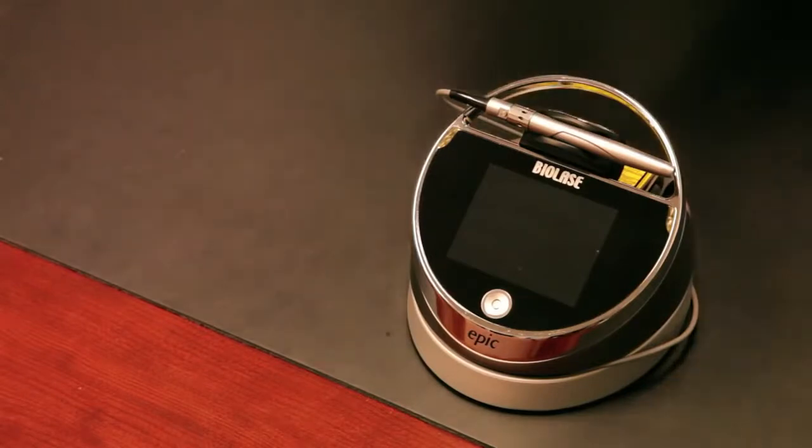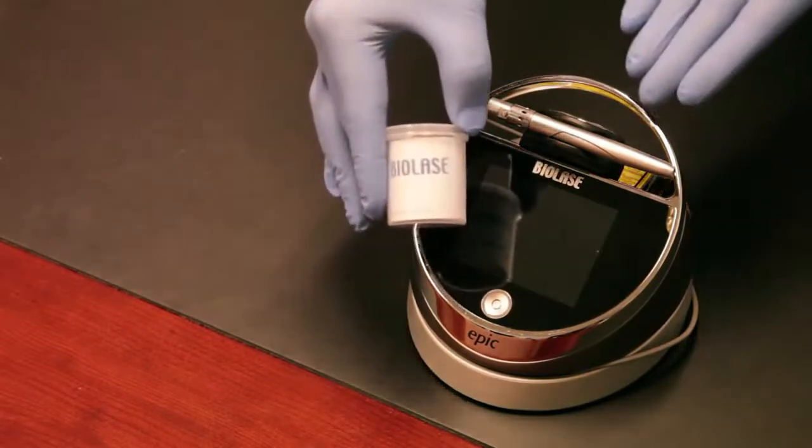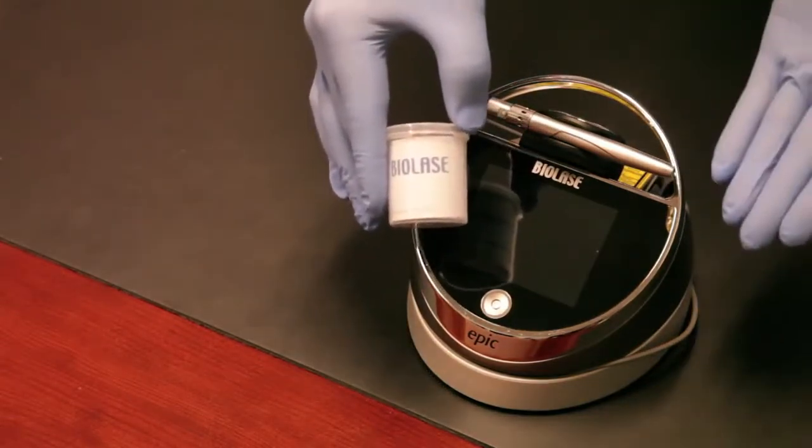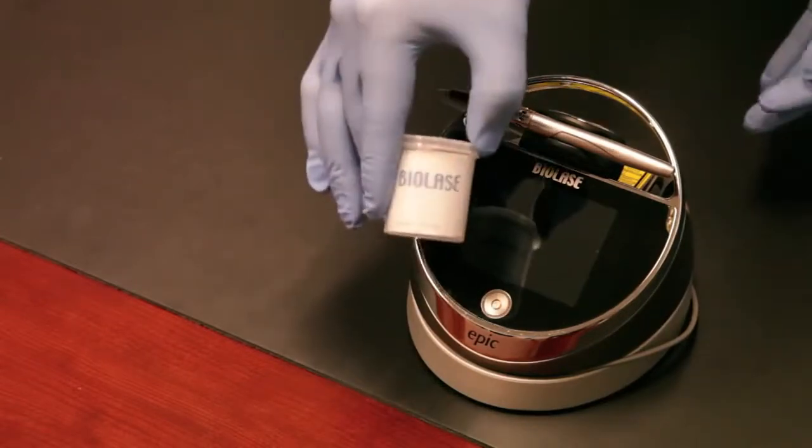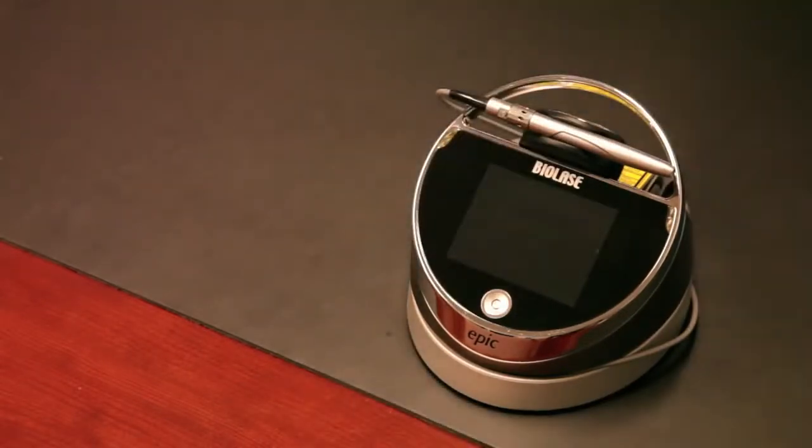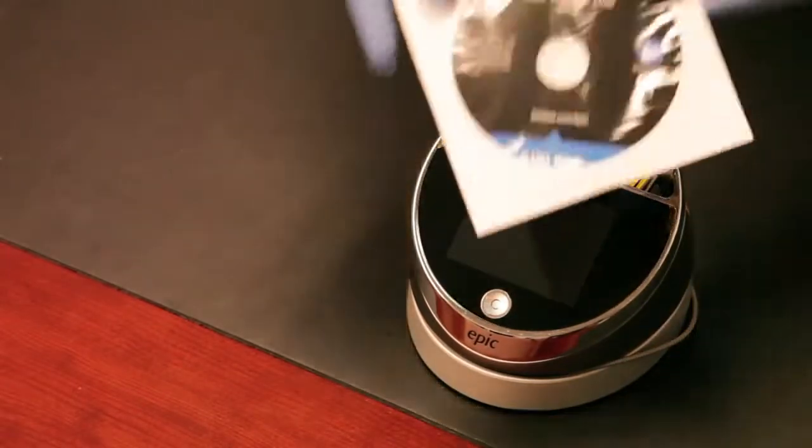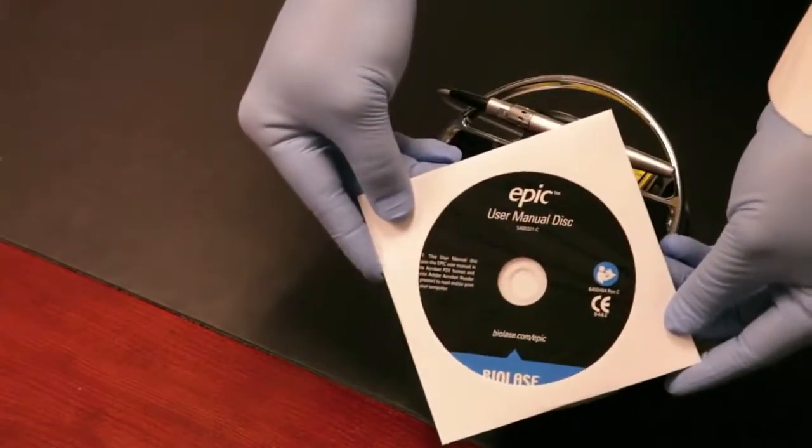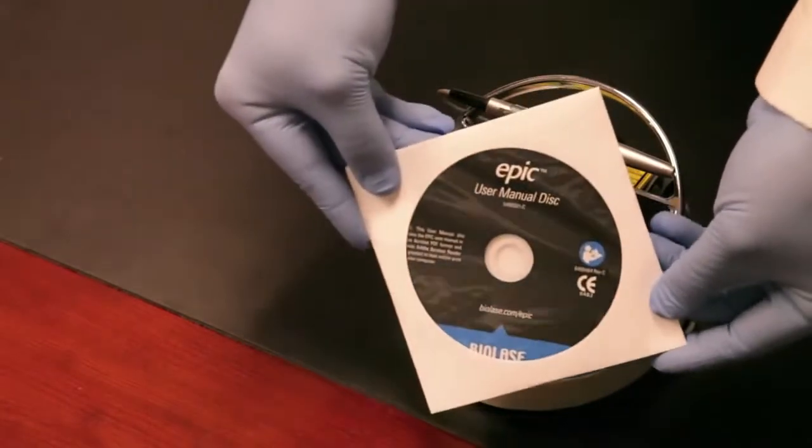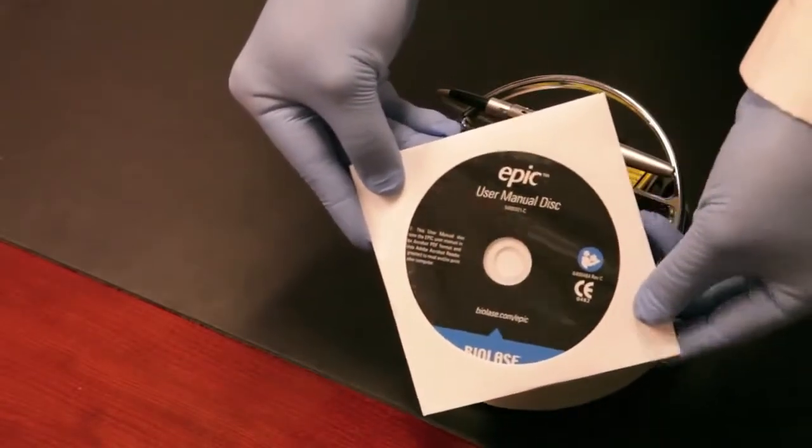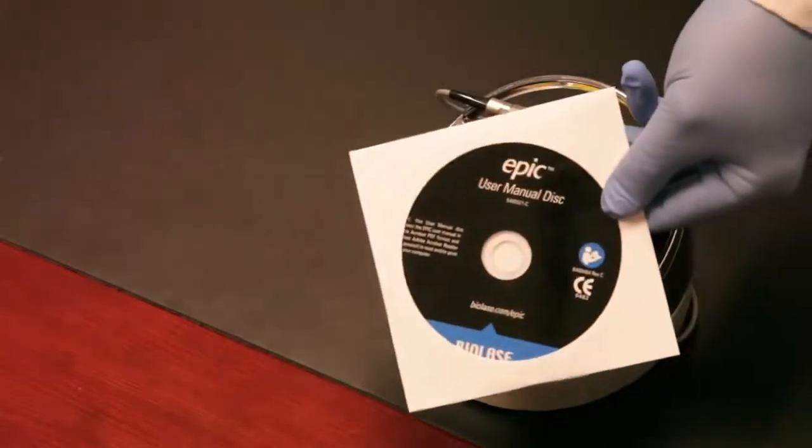There's also a number of other components. There's a tip initiation kit. When you use the laser to cut soft tissue, you have to initiate the end of the tip, which means darkening it. This kit is for that. It's very simple to do. Also batteries for your foot pedal, and our user manual, which comes on a disk. We highly recommend you read this before using your Epic laser.